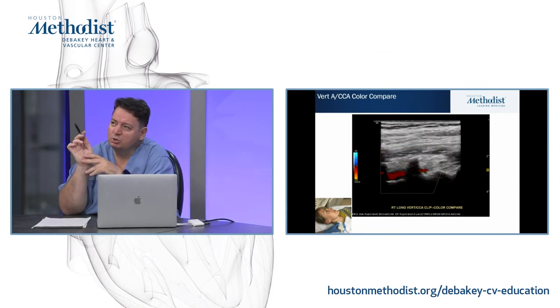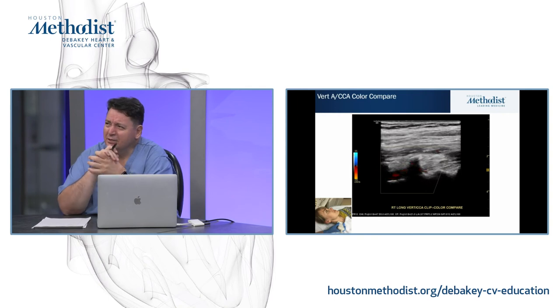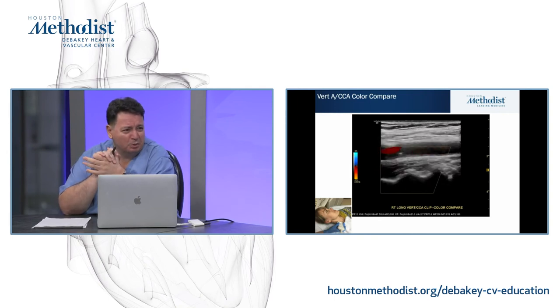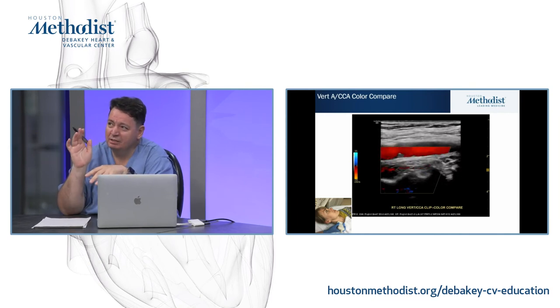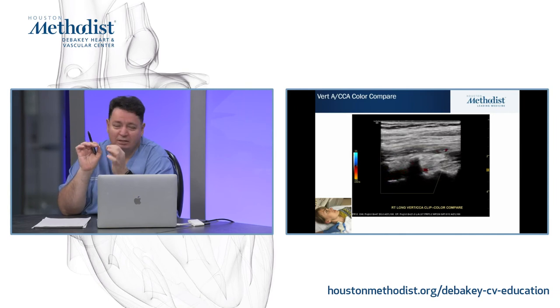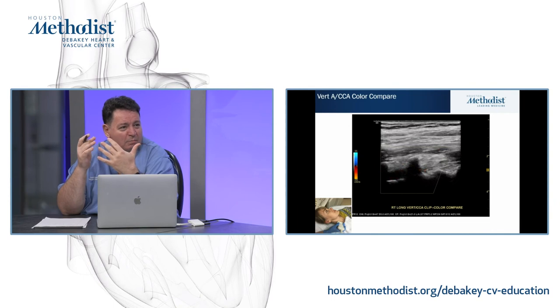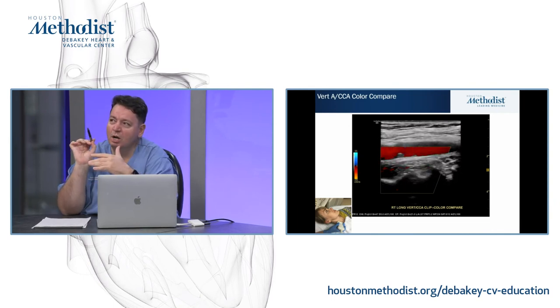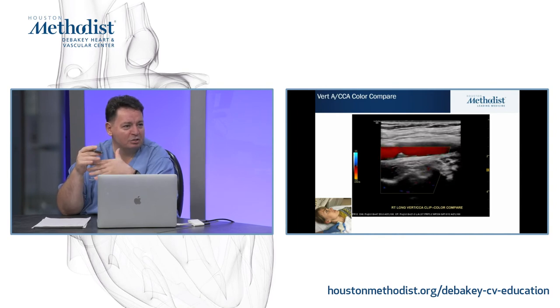And I think this is the most critical part. I'm really happy that we had discussion about our protocol for 2 years, every Friday morning. And finally, everybody agreed that the vertebral and the subclavian need to be at the end, and to confirm with this video clip the direction of the vertebral and the common. You can miss the angle of the color box, you can miss so many things, but in that one video clip, to be able to show that your carotid and the vertebral go in the same direction, I think is crucial.